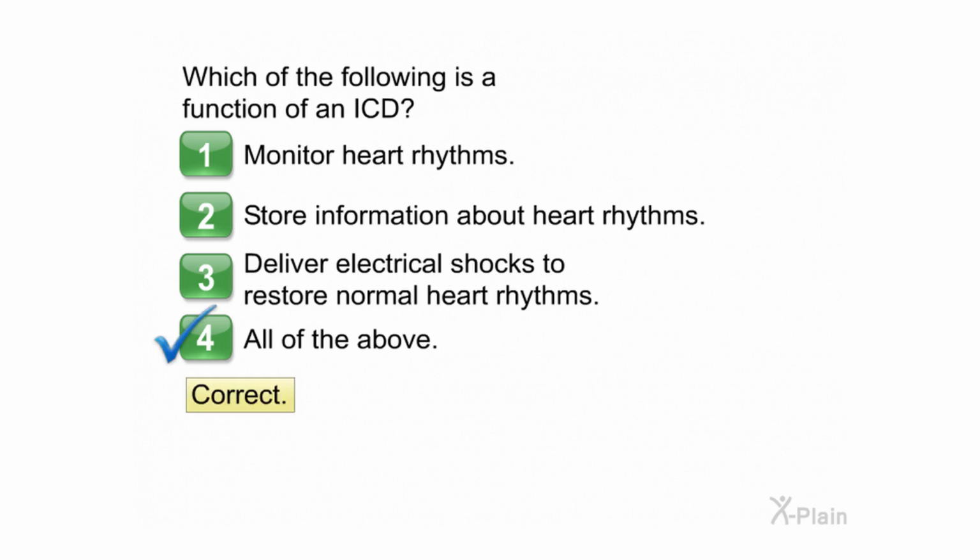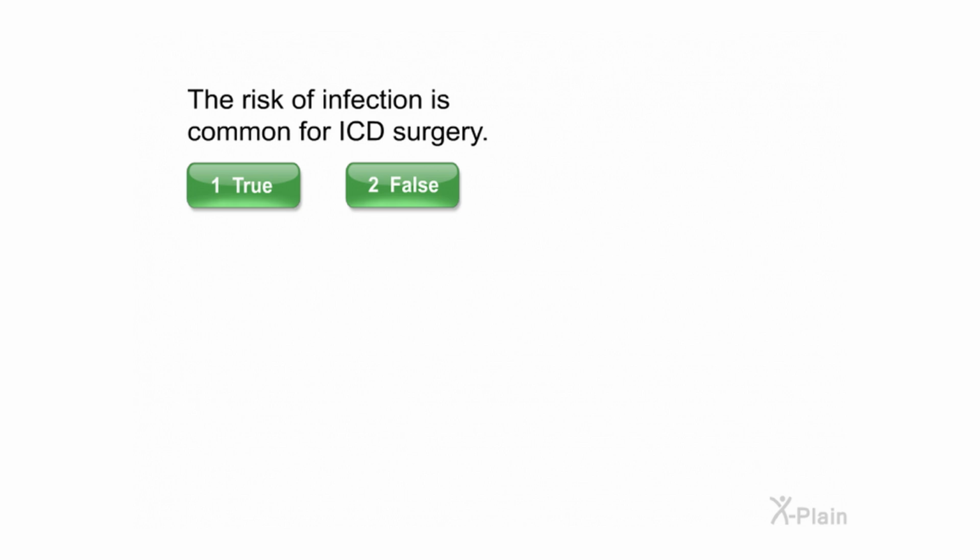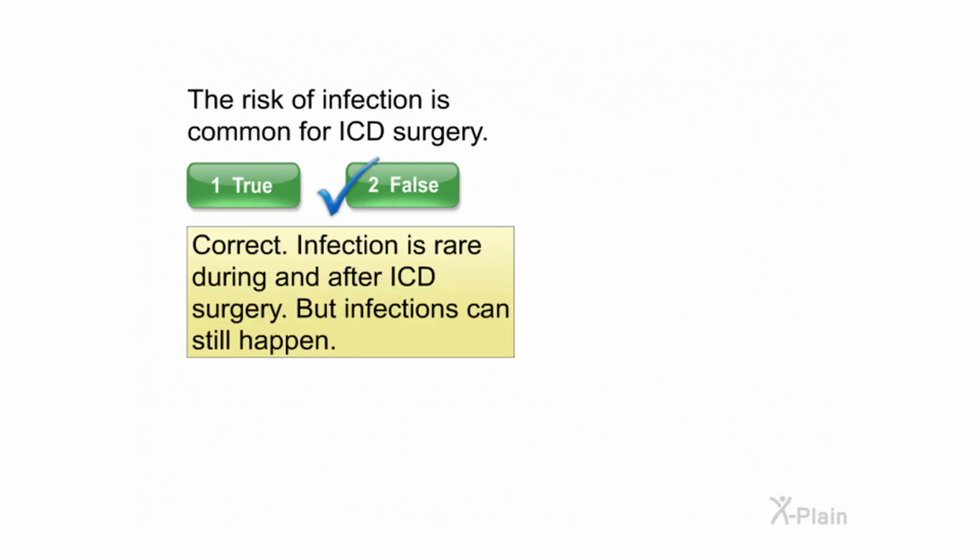Correct. The risk of infection is common for ICD surgery. Select true or false. Correct. Infection is rare during and after ICD surgery, but infections can still happen.